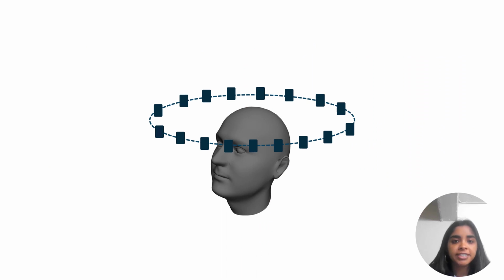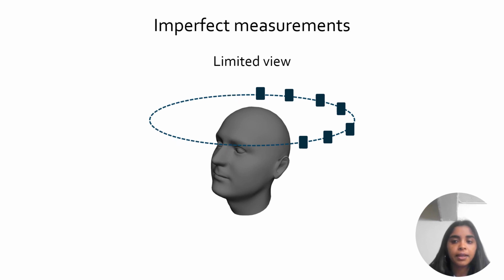In a full-ring PAT system, the object being imaged is fully surrounded by transducers. However, due to resource constraints or physical constraints, PAT might have to be done with an incomplete ring. For example, the limited view problem occurs when we can't surround the entire object with transducers. This means that any waves propagating away from the available transducers would be missed. Another setting is the spatial aliasing problem, in which only a few transducers are evenly spaced around the imaging target.